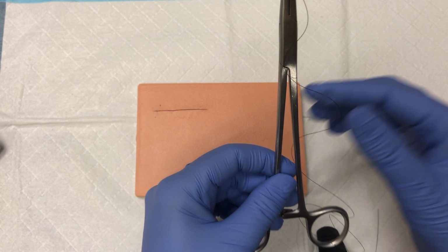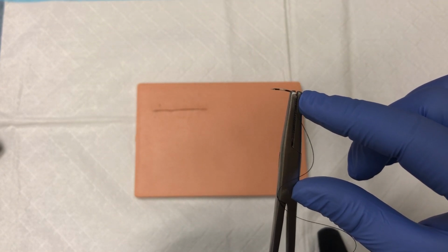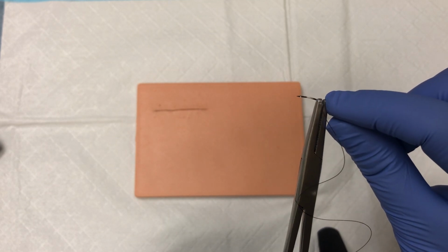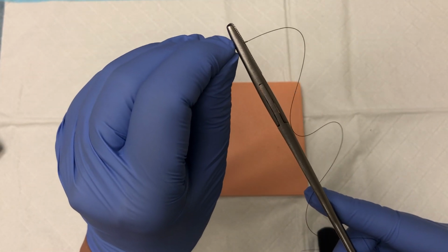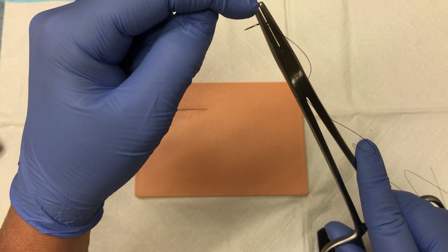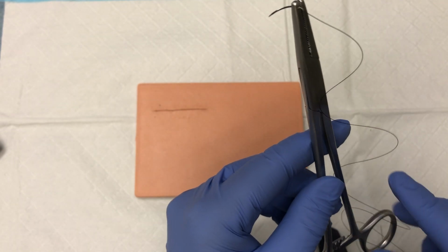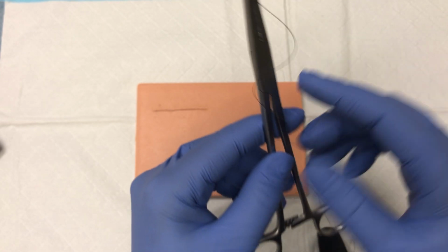Needle drivers themselves, we always want to ensure that the needle is at the furthest aspect of the needle driver. You would not want to have the needle toward the middle of the needle driver. The reason for that is then all of that additional space is in your way. Let me demonstrate that for you. So if I had my needle and I clamped it here, then I have to get all of this aspect of the instrument into the patient, and then I can use my needle. Much more beneficial to be as far down as we possibly can. That allows for less depth of the instrument into the patient themselves.